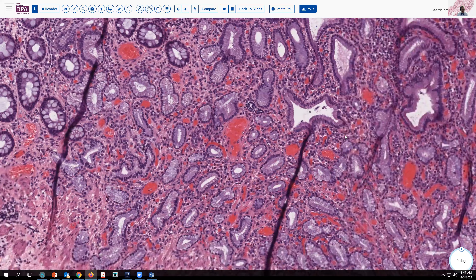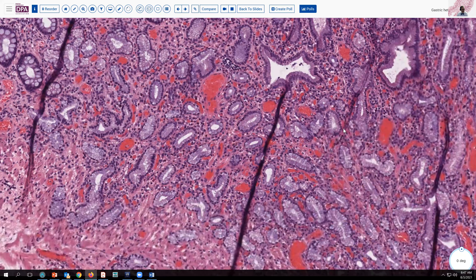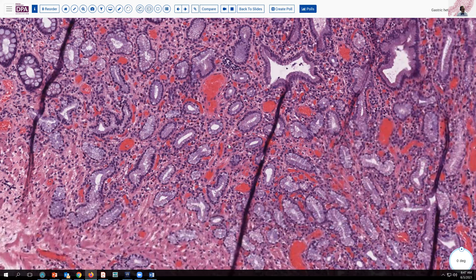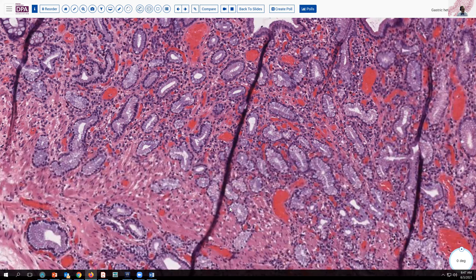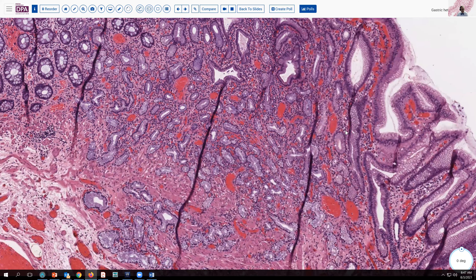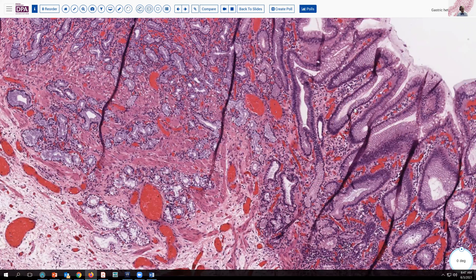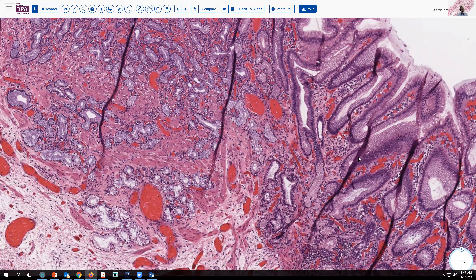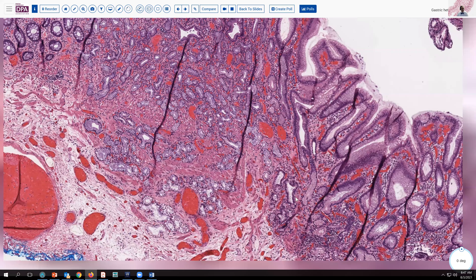Looking around a little further, we see that these are not normal crypts — they look more like antral-type gastric glands or crypts. Looking a little further here again, we see this loss of normal colonic cells with this more deep antral-type tissue.